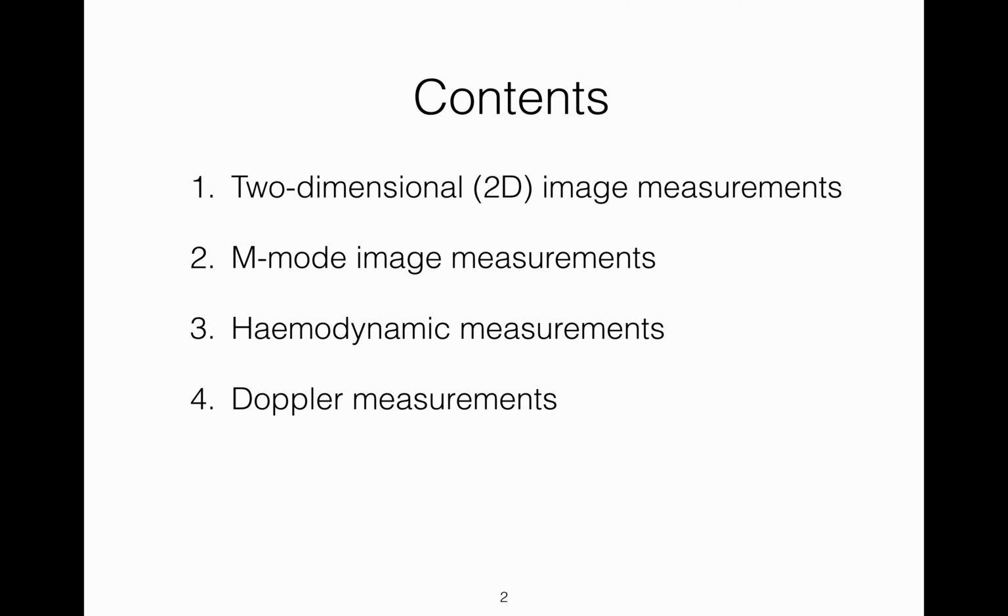The contents of this lecture are 1. Two-dimensional image measurements. 2. M-mode image measurements. 3. Hemodynamic measurements. And 4. Doppler measurements.